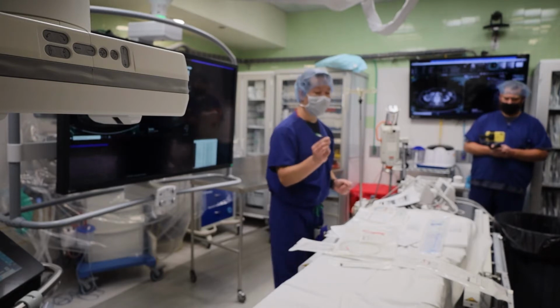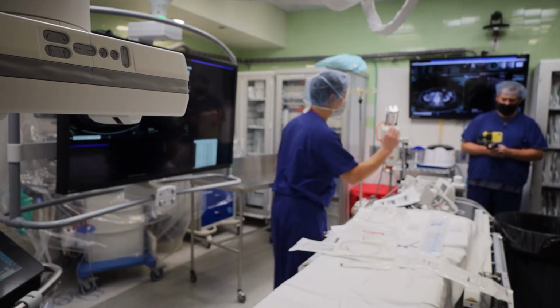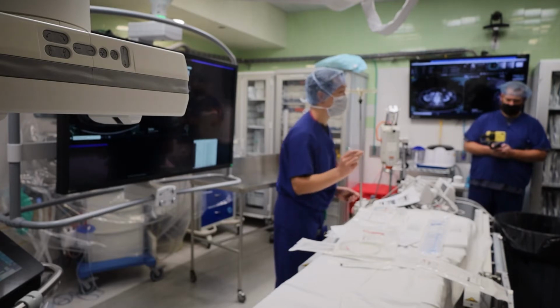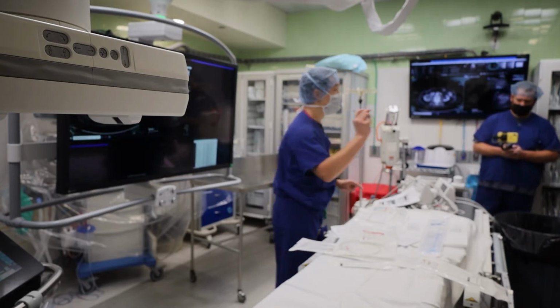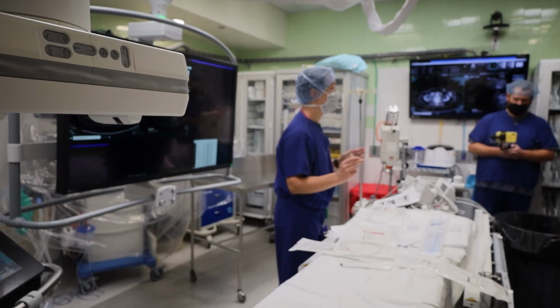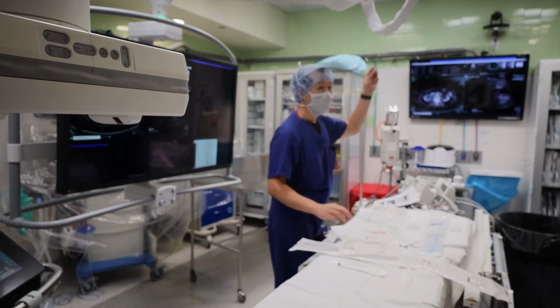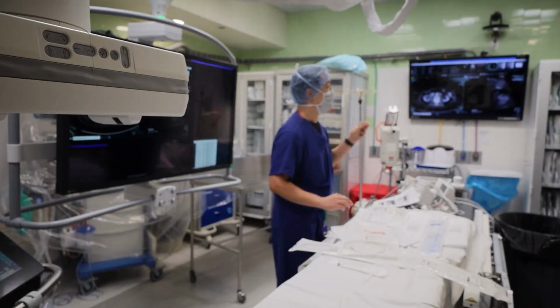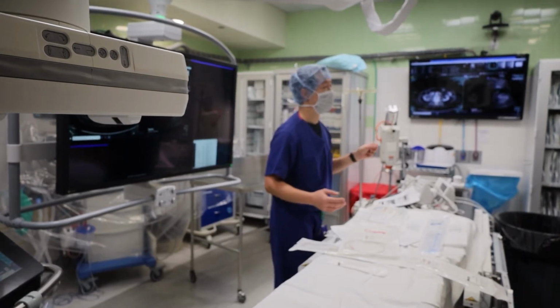Okay, so you put this in. We said this is a 21 gauge needle. What size of wire goes through a 21 gauge needle? 0.021? No, smaller. You guys tell me. 0.018 goes through a 21 gauge needle. 0.025s do not. 0.035s do not.